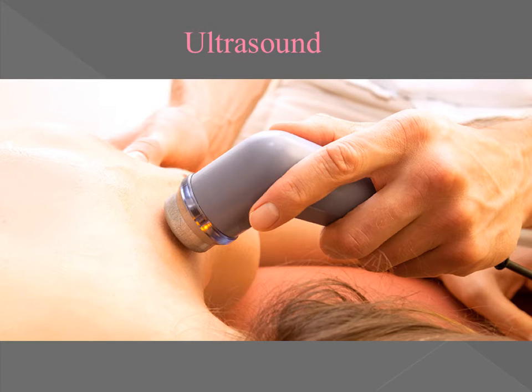But before we can actually understand how to clinically apply it, we certainly have to figure out scientifically and physiologically what it is that ultrasound is purported to do within the human body. What we know about therapeutic ultrasound is that it's a deep penetrating agent, right? That produces changes in the tissue temperature that can either be thermal or non-thermal. So this is the first deep penetrating modality that we'll talk about in this course.